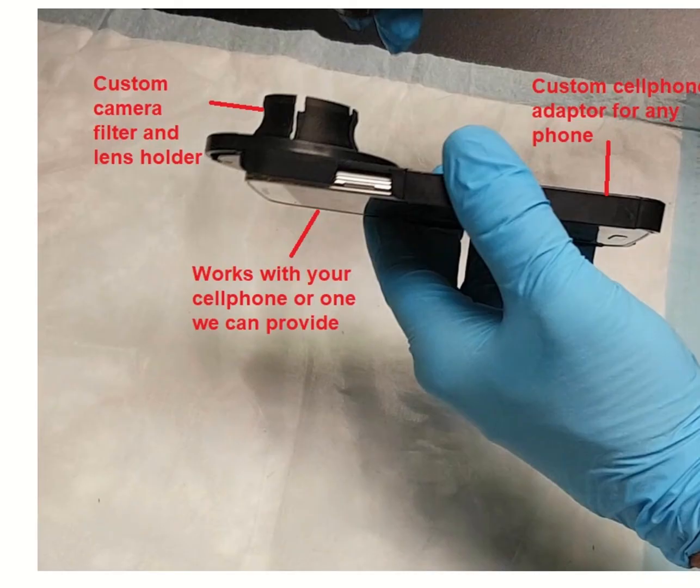The Forensic Cam includes a custom smartphone adapter to hold the smartphone and a custom interchangeable optical adapter that holds the different camera filters and magnification lenses.